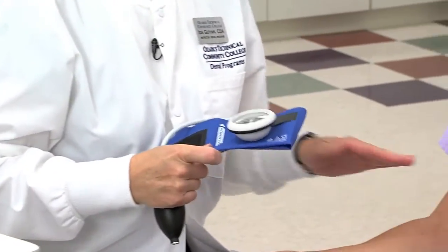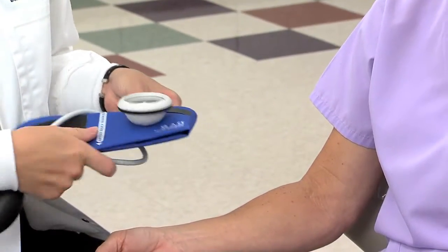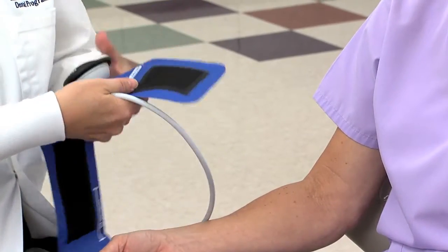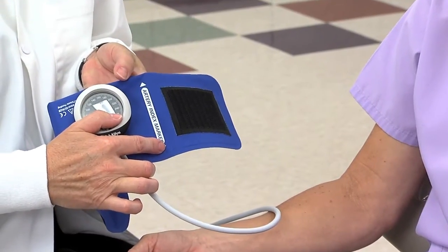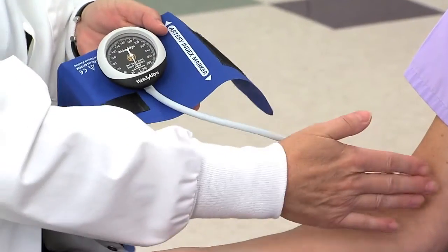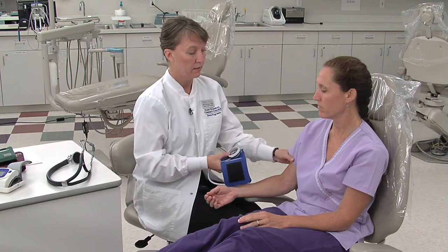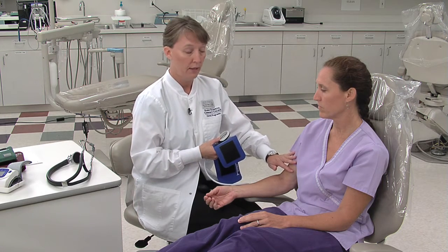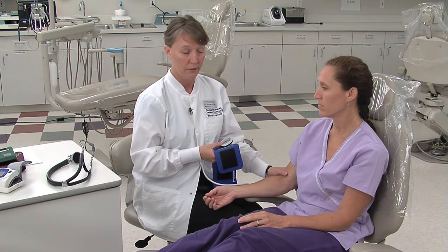We're going to be using the small adult cuff, and that's judged by the size of the patient's arm. There is a marker on the cuff that tells you where the cuff needs to be placed in relation to the artery of the arm. One thing that you want to make sure of is that the sleeve of the patient can either be pushed up, or if they have a long jacket, that they need to remove at least one side so that you can get to the arm easily. If it's a thin shirt, a lot of times you can take the blood pressure over the shirt itself.